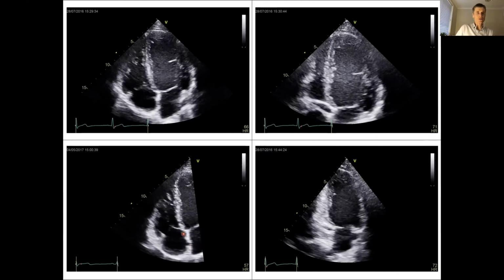The inferior margin of the right atrium, as you'll remember from the anatomy lecture and from the list that you can refer to in a moment, the coronary sinus is an important structure within the right atrium that you can often see. And if you tilt a probe posteriorly, you'll certainly oftentimes see the coronary sinus at the back of the left atrium and emptying into the right atrium there. And then, of course, we can see the features of the right atrium from the subcostal view as well.